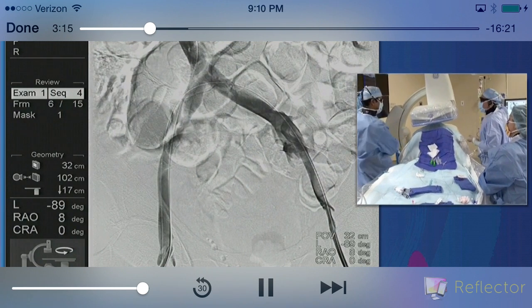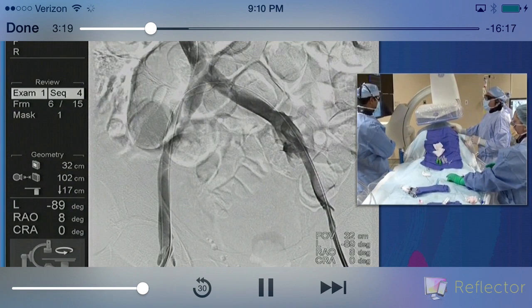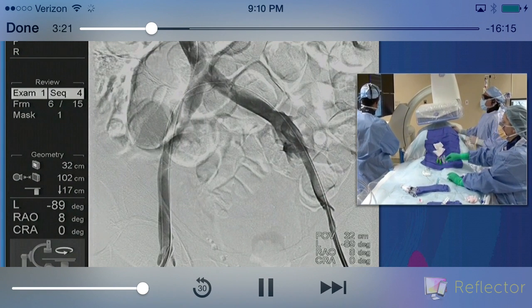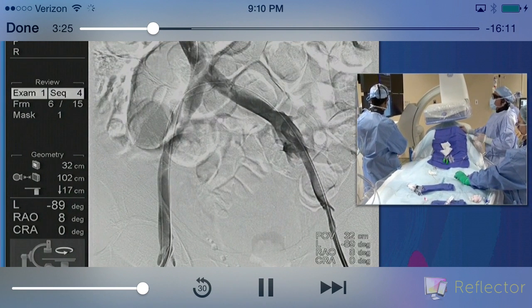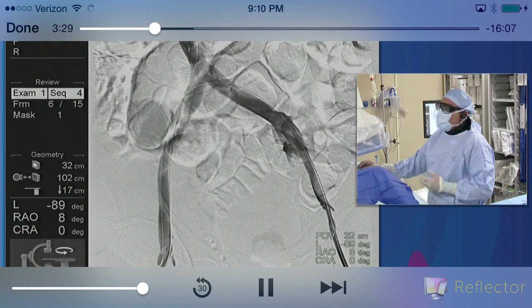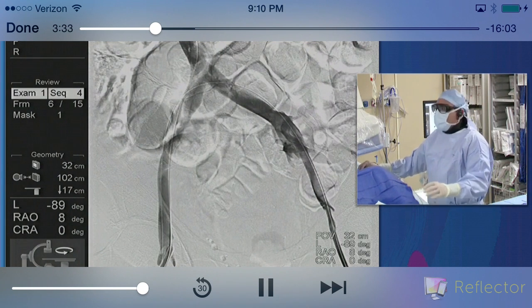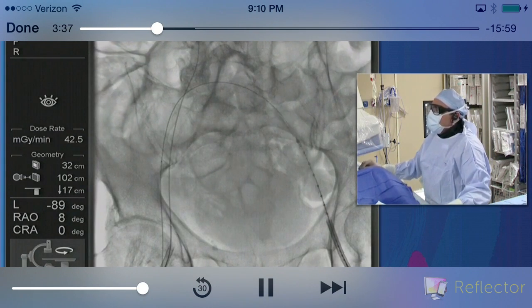We'll agree with that. So now we're going to go ahead and with the up and over access, I'm going to put the IVUS catheter in, and we're going to do a pullback. Usually we'll go from the IVC and down, but because we have the wire up and over and we're looking at both sides, I'm going to go from the right common femoral vein through the right external, internal iliac vein, and back to the left side and see what we find, if anything.